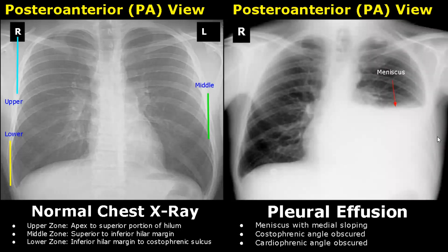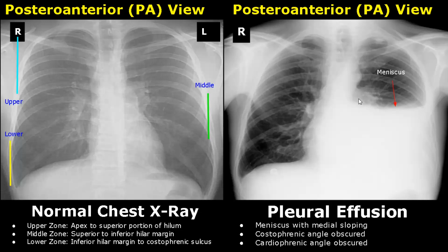Furthermore, pleural effusions can be best seen in a lateral decubitus view, which helps in diagnosis. Here is another image of left-sided pleural effusion. The meniscus is somewhat flat but we can still see it.